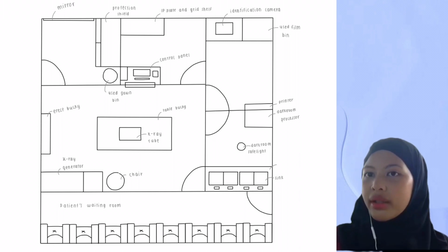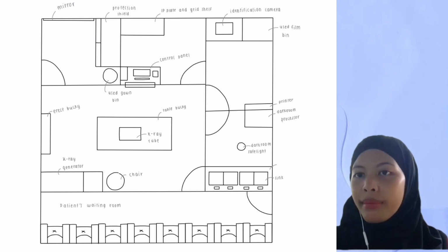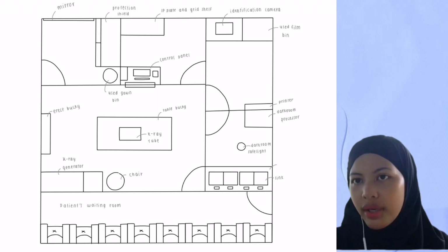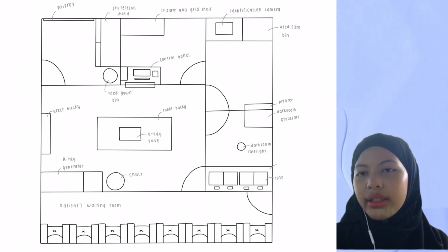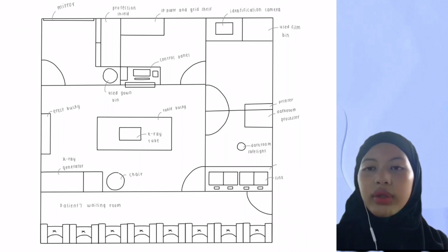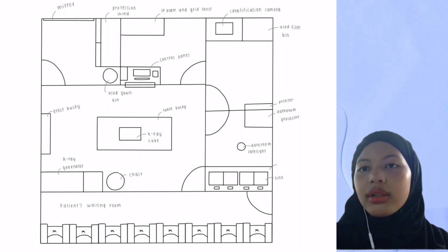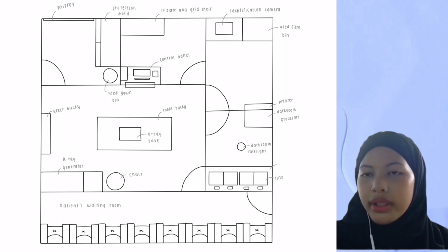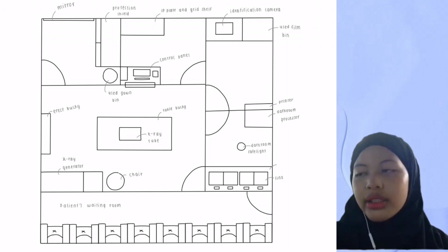Next, the control panel must be placed at the other side of the X-ray room. It must not be placed at the patient's waiting room. This is very important. Why? Because the control panel cannot be at a place where it's reachable for the patients, in order for the patients to not mess around with the X-ray instrument, mostly the control panel itself. In addition, in the control panel, there is the button used to expose the patient. So it is very dangerous.